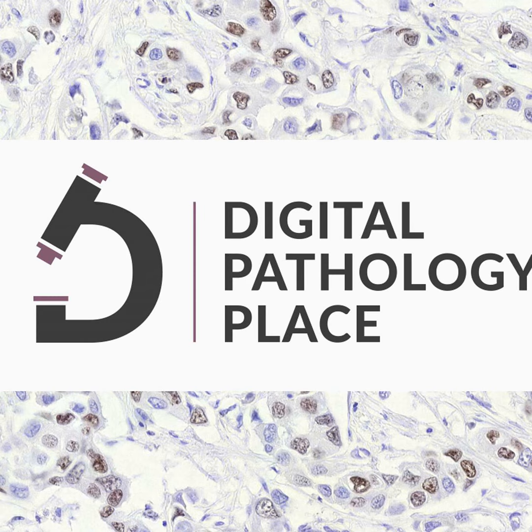This proves that digital pathology can improve efficiency and accuracy and produces the tremendous advantage of remote access to pathology services. However, there are challenges associated with the adoption of digital pathology, including the need for infrastructure, standardization, and training. Also, navigating the regulatory landscape of digital pathology, including the need for regulatory approval of AI algorithms and regulatory compliant validation of digital pathology systems, is a significant effort.